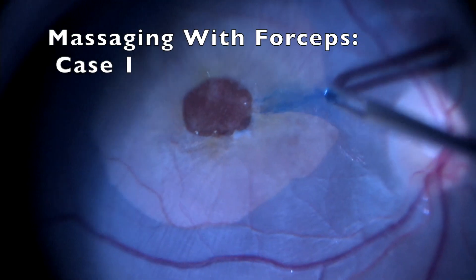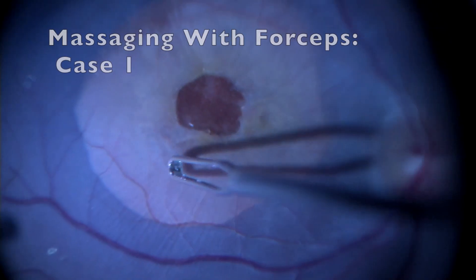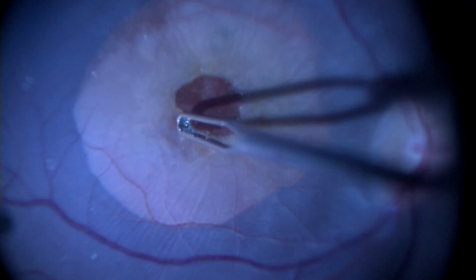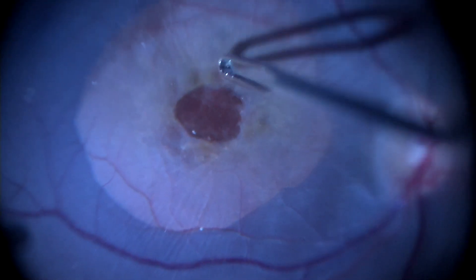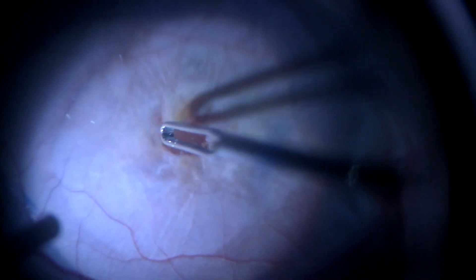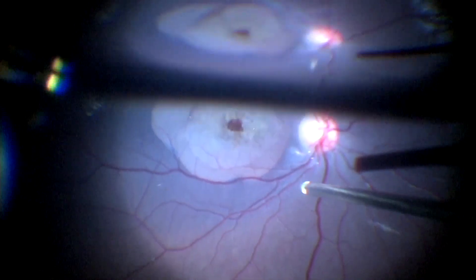In the past, we have been massaging the edges of the hole with forceps so as to relax the margins. After this massaging maneuver, air fluid exchange is done and one can see the hole reducing in size.